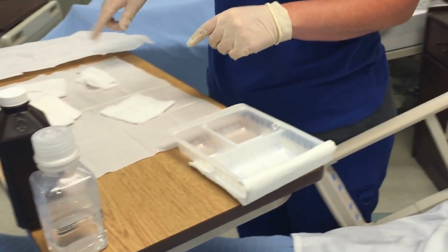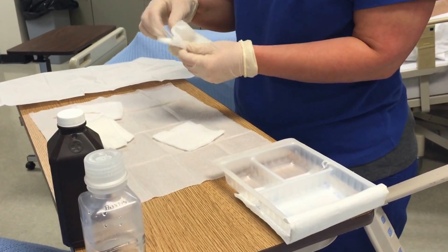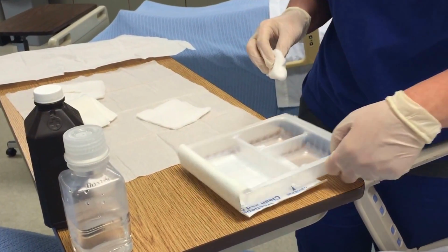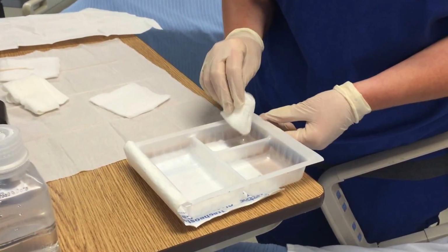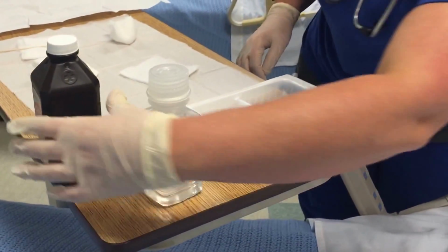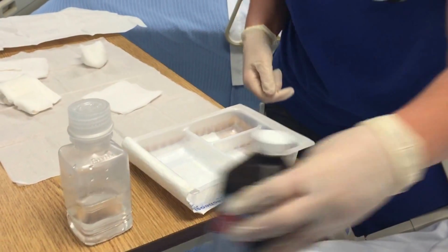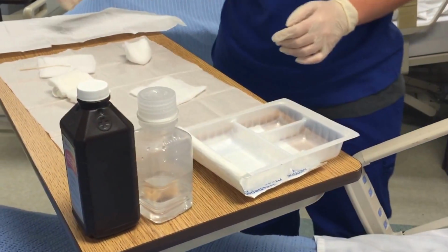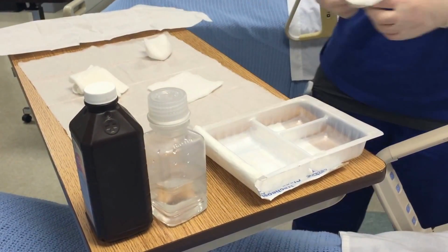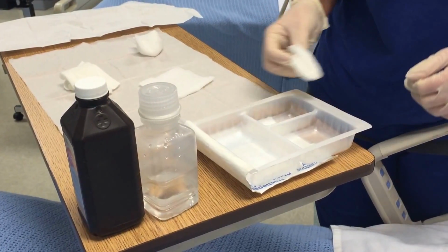Now, our last little bit, we have our Q-tip with our saline, or with our 4x4. We are going to dip into our third tray with saline. And then we're going to get our peroxide and pour a little bit of peroxide, make it half and half in here, because according to our policy, we are supposed to clean the faceplate and the stoma with half and half and saline. So now we're going to clean in here and dip here.